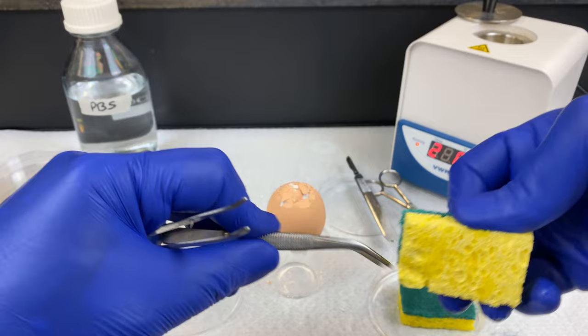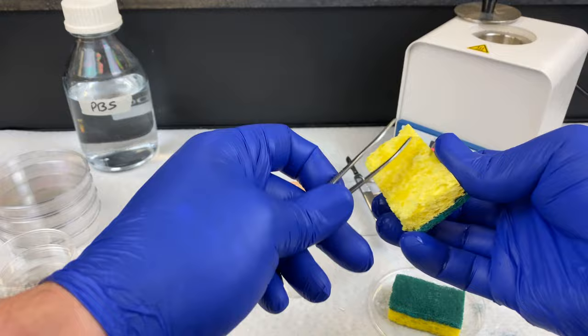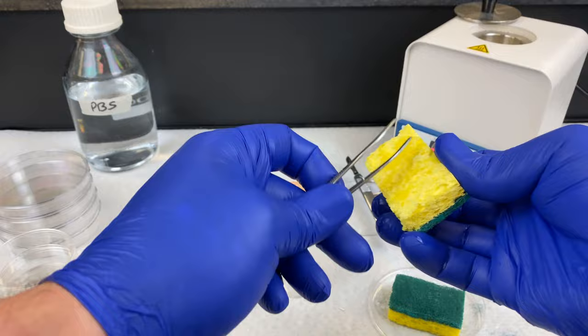When working with a chicken embryo, if you have chicken tissue on the instruments when you place them into the Steri, after a few minutes it'll start smelling like a barbecue — you're literally cooking chicken. So make sure you clean all your instruments, dry them, and then place them into the Steri for only 10 seconds.